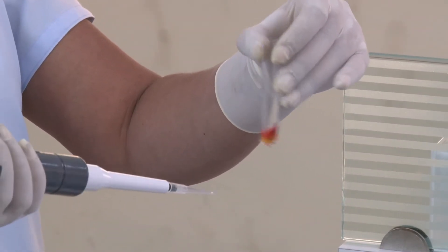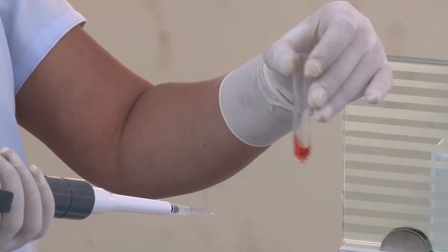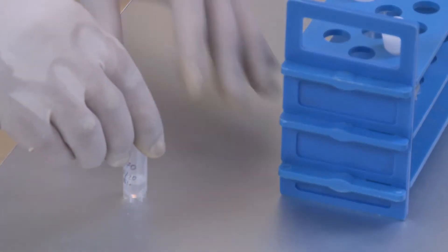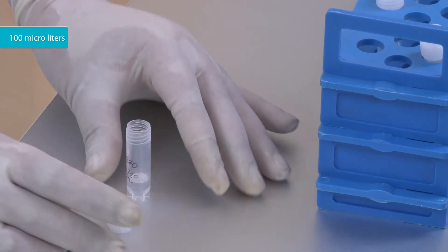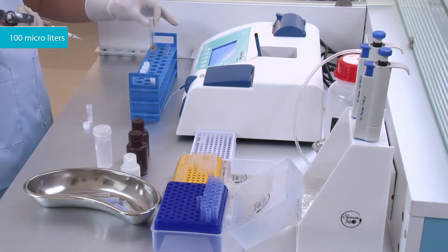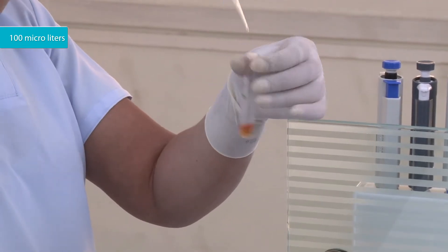Shake it well. Add 100 microliters of diluted seminal plasma to the tube labeled test. Shake it well.